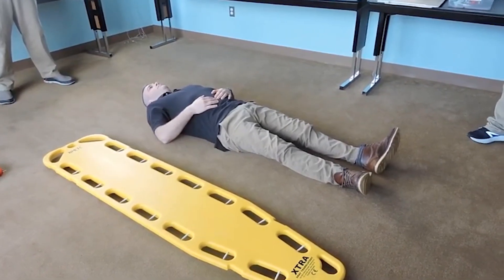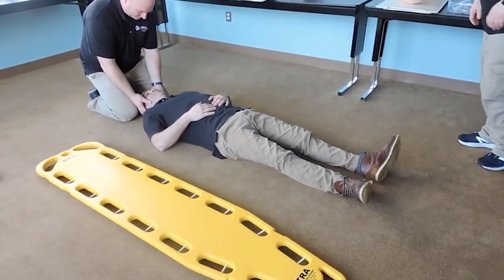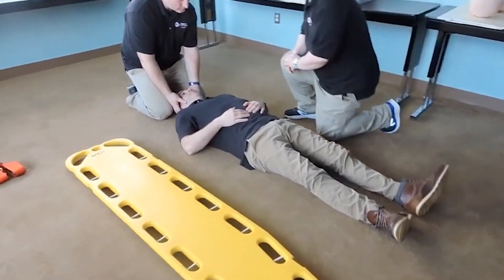This is the ATBSI. I'm going to direct my partner to come in and take inline mobilization of the C-spine. I'm going to approach my patient. Sir, how are you doing today? My name's Joe with the ambulance company. Are you okay if I check you out?